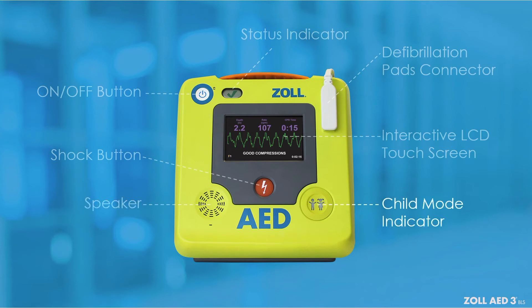The child mode indicator will illuminate when PD-PADS-2 pediatric electrodes are plugged in to the AED. The built-in microphone records audio during a rescue for case debriefing.